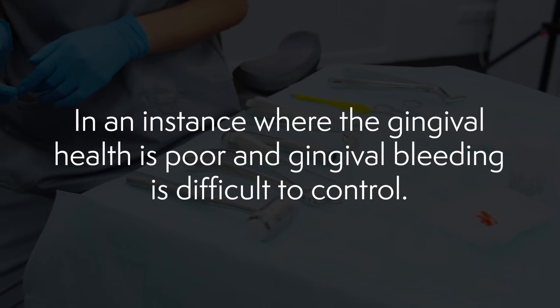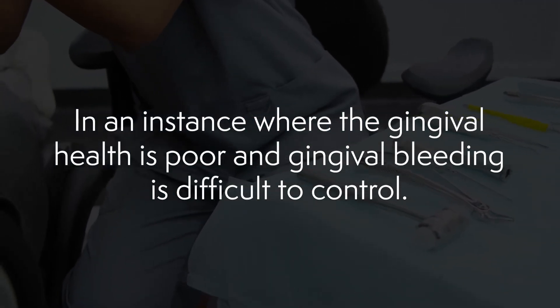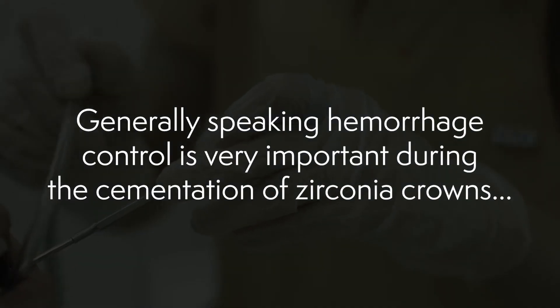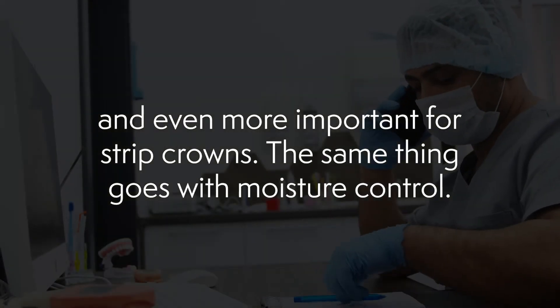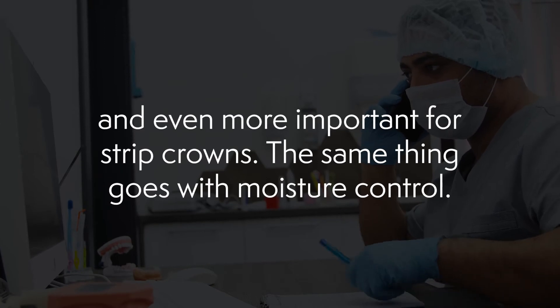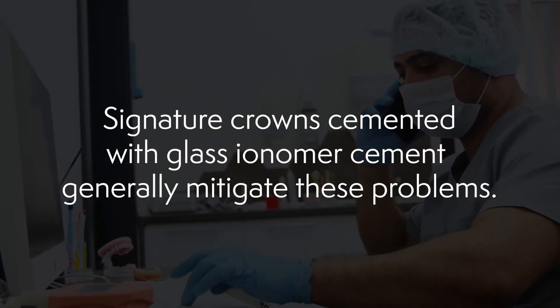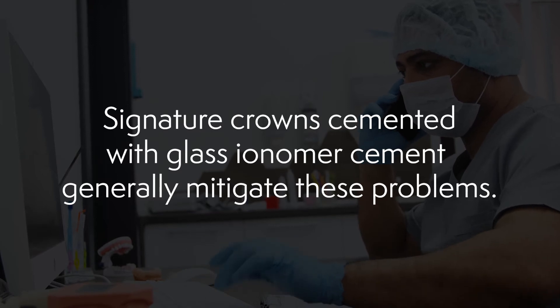I'd like to list a few clinical scenarios as to when and why pre-veneered crowns might be used. Number one: in an instance where the gingival health is poor and gingival bleeding is difficult to control. Generally speaking, hemorrhage control is very important during the cementation of zirconia crowns and even more important for strip crowns, and the same goes for moisture control. But signature crowns cemented with a glass ionomer cement generally mitigate these problems.